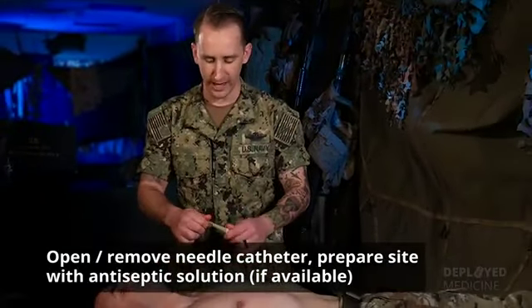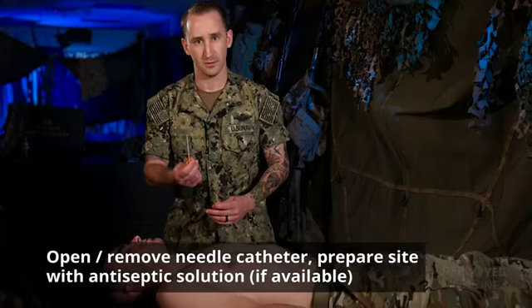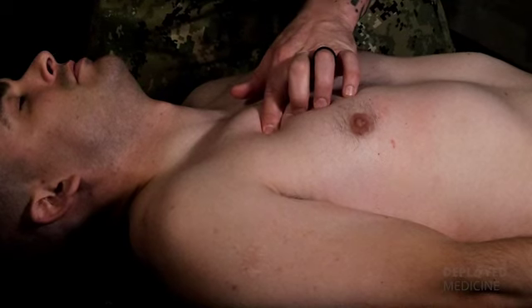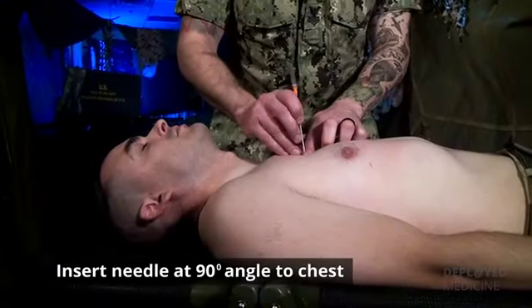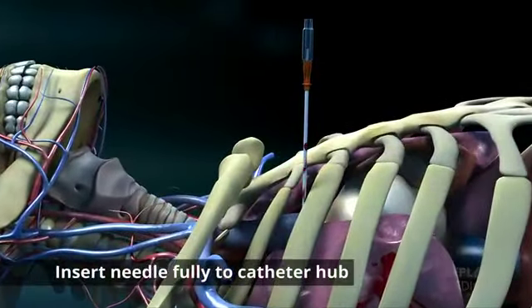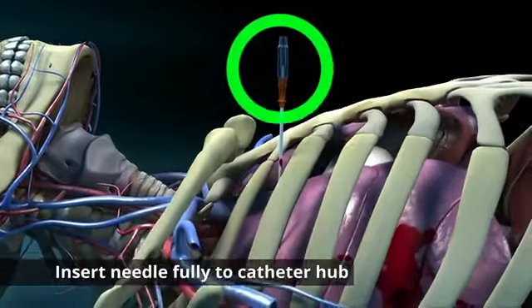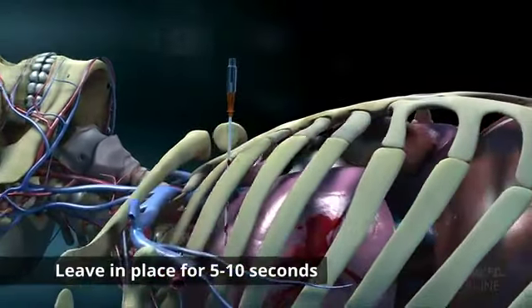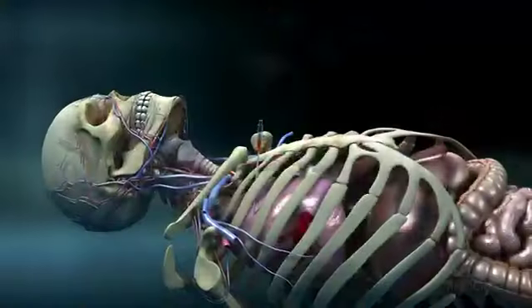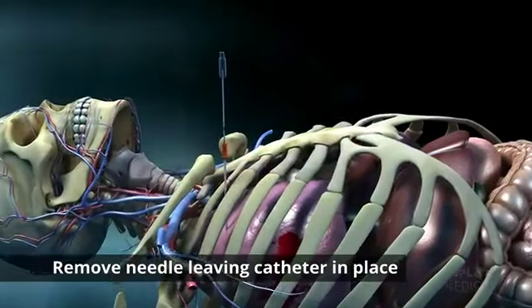Once I've identified my site, I'm going to remove the needle catheter. Remember, it's 14 or 10 gauge, 3¼ inch. I have my site identified, and I'm just going to insert this at a 90-degree angle perpendicular to the patient's chest. Insert the needle and catheter fully to the catheter hub and leave in place for 5 to 10 seconds to allow complete decompression to occur. After the decompression has been performed, remove the needle, leaving the catheter in place.